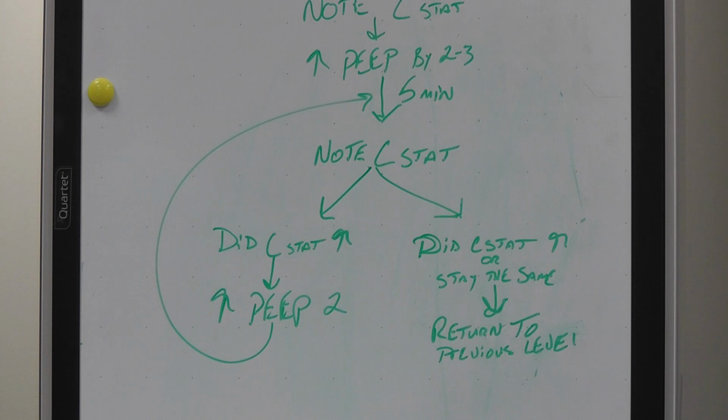And that's going to be your PEEP of best compliance for that time period. Now, an hour later, you may need to do this again, and potentially you will have recruited some lung based on that PEEP. But in the initial study, that's how you do it. Okay? We're going to do it on the ventilator so you guys can see it there.